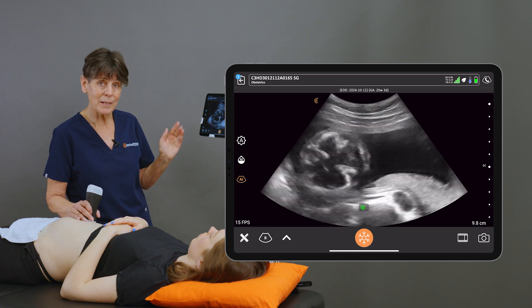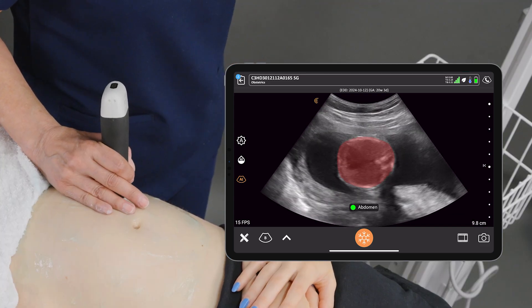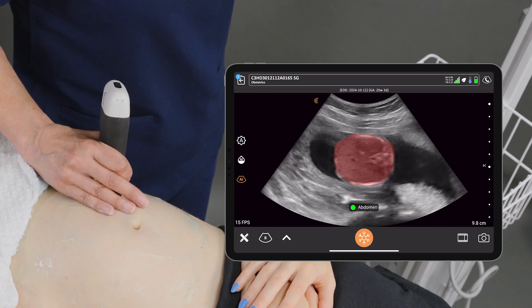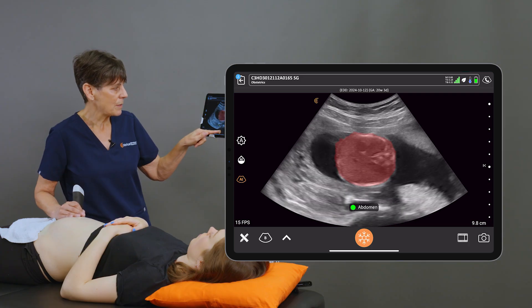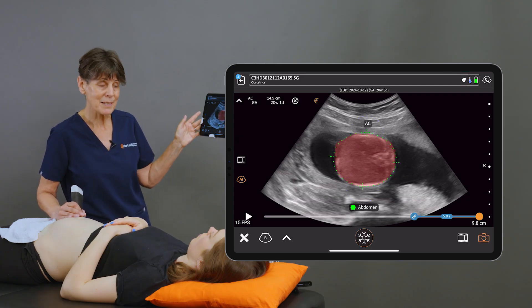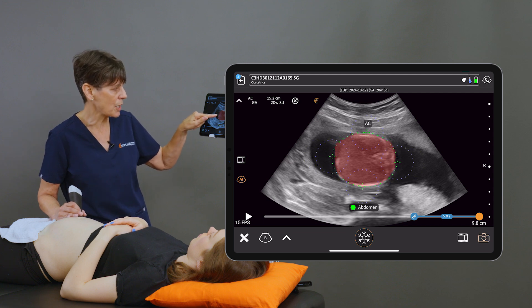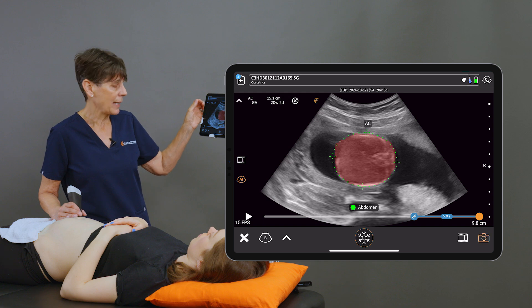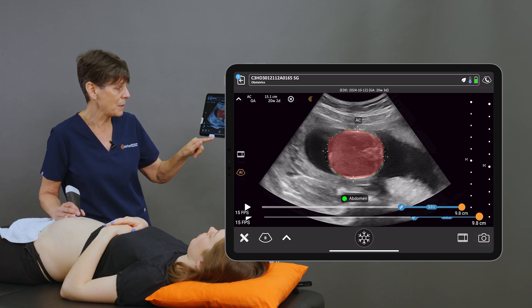Then we'll move on to the abdomen. We're going to slide down to the abdominal level, and the AI has recognized that we're looking at an axial slice through the abdomen. If I freeze the image, the calipers are going to be placed, and they're accurately placed here. If for some reason they weren't, I always have the option of adjusting my calipers after the fact. We're getting a gestational age of 20 weeks and 2 days, which is very accurate. So we'll take that image.